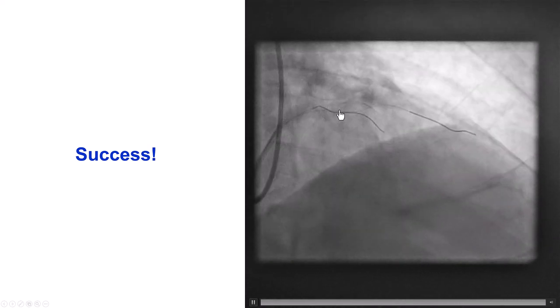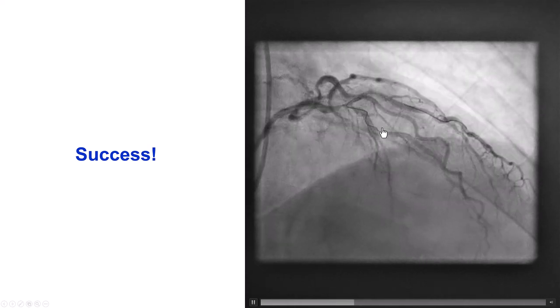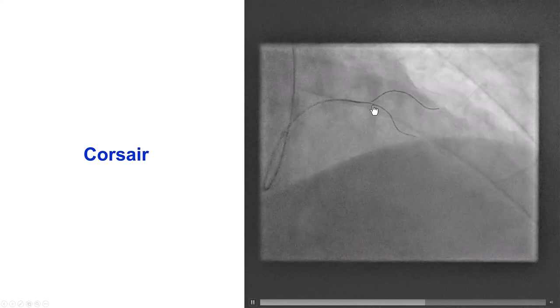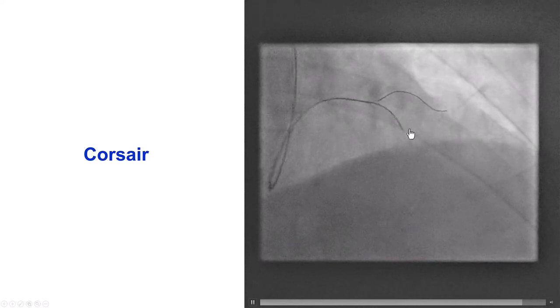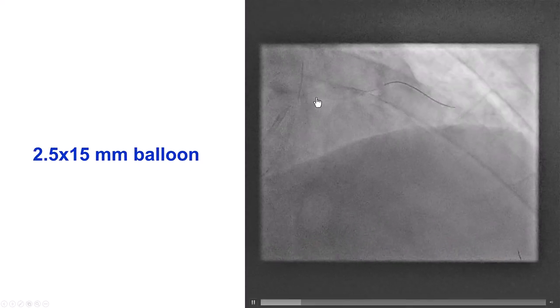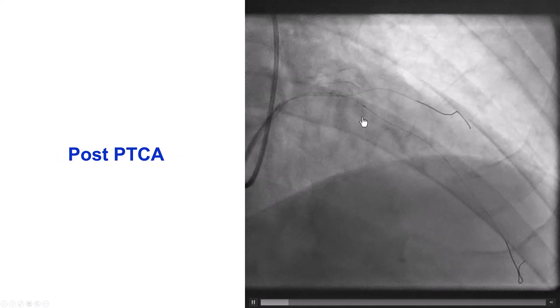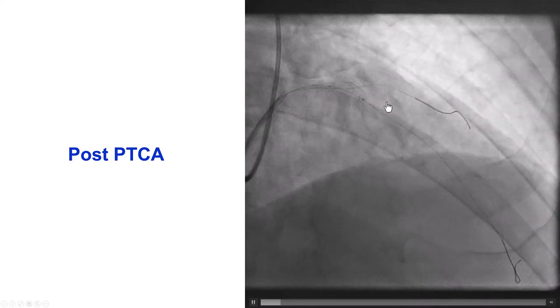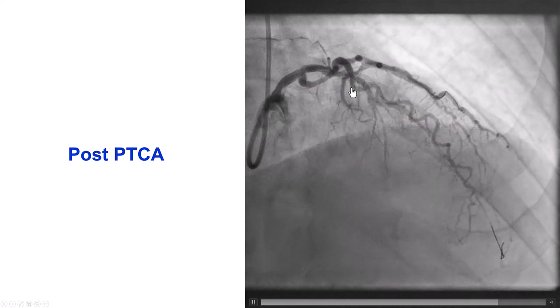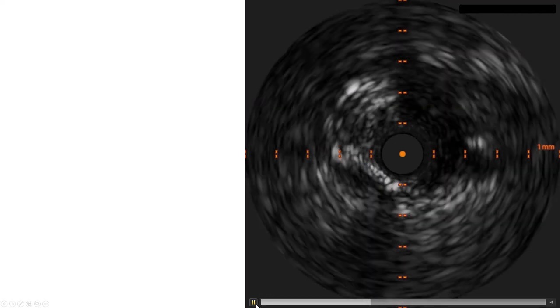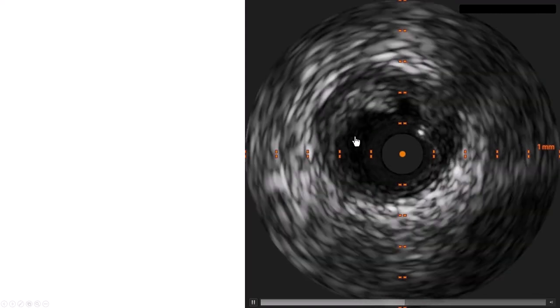The problem is that there is difficulty advancing the wire further down because of the 180-degree bend in the wire. The next step is to advance a microcatheter — this is our Corsair — into that reversed wire and into the vessel we have wired. We then remove the Sion Black guidewire and advance a workhorse guidewire. We now have guidewires in both the LAD and the diagonal. We pre-dilated with a 2.5 mm balloon, which restored better flow. Intravascular ultrasound demonstrated some diffuse disease distally with a lot of plaque next to the bifurcation, appearing soft without much calcification.